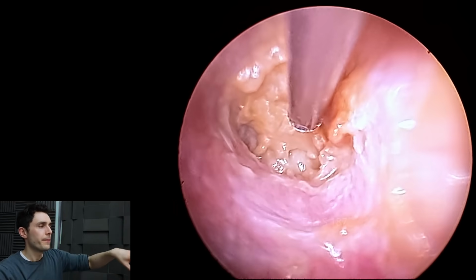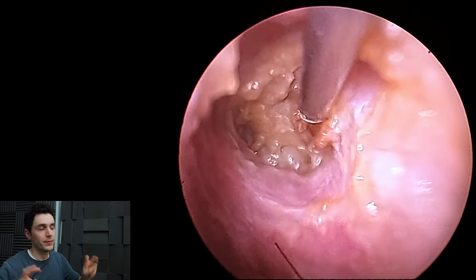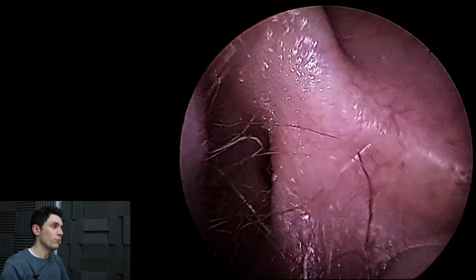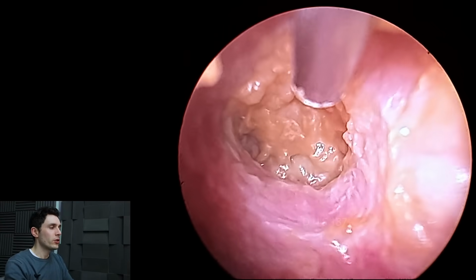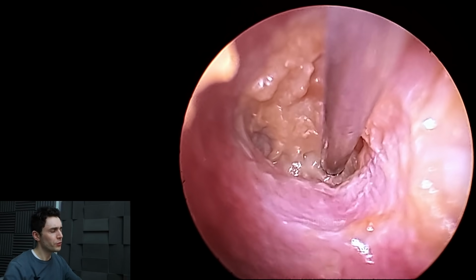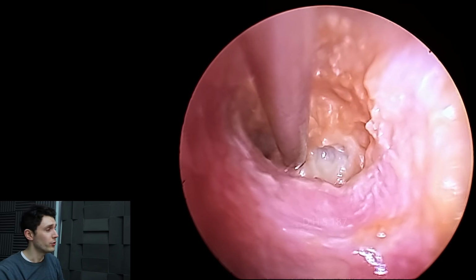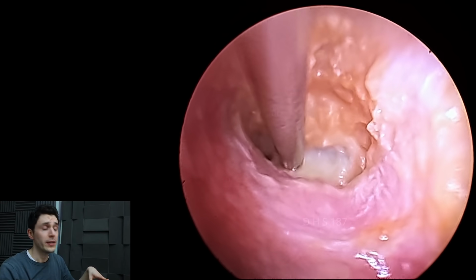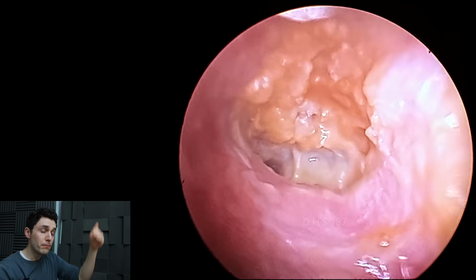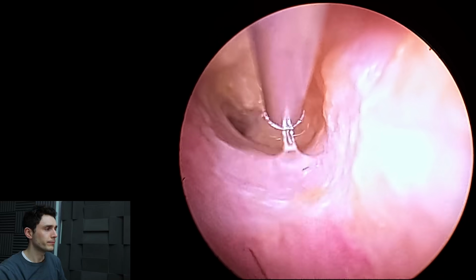And the reason is that this patient has what we would call in fancy terms a neotympanum. Now what that really means is that there's just a fake eardrum overlaying the real eardrum, which is just dead skin, basically. So we're going to try and clear up this eardrum a little bit, and there's slime all over it. Once we debulk the slime, we'll actually be able to peel off this fake eardrum, and that'll improve the hearing. Now we're not going to be able to get 100% of it, but if we can get rid of most of it, that will alleviate some of the hearing loss, and then we can send the patient around to the GP for some treatment.